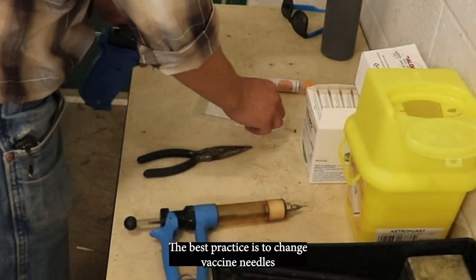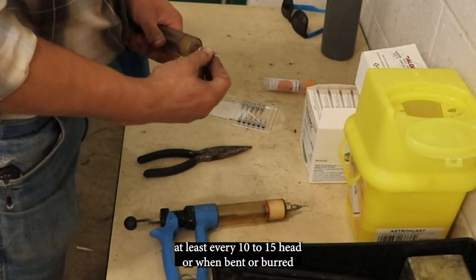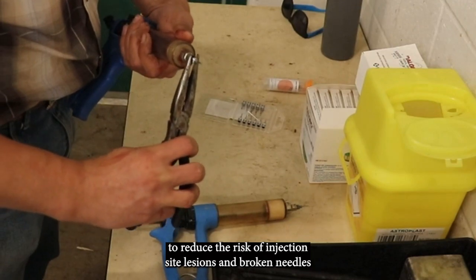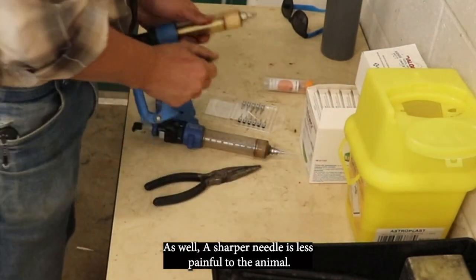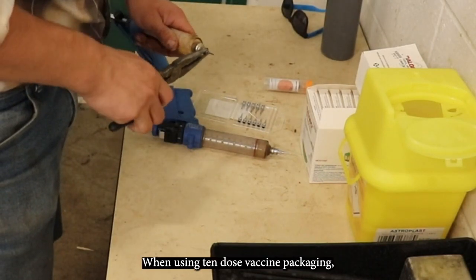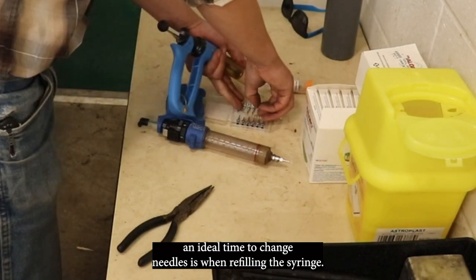The best practice is to change vaccine needles at least every 10 to 15 head, or when bent or burred, to reduce the risk of injection site lesions and broken needles. As well, a sharper needle is less painful to the animal. When using 10-dose vaccine packaging, an ideal time to change needles is when refilling the syringe.